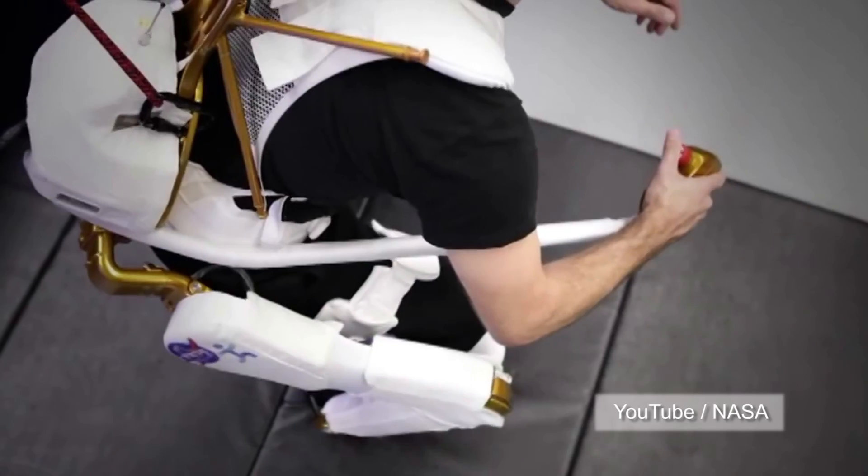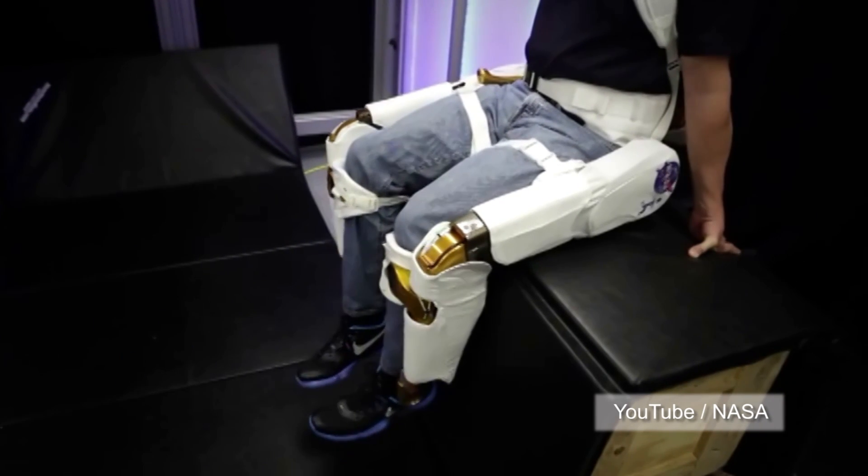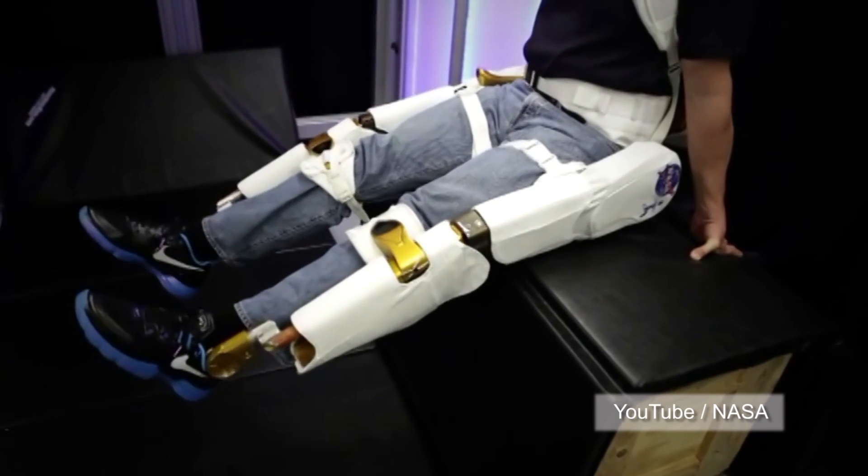The X-1 is currently in a research and development phase. NASA says the X-1 is more comfortable, easier to adjust, and easier to put on than previous exoskeleton devices.